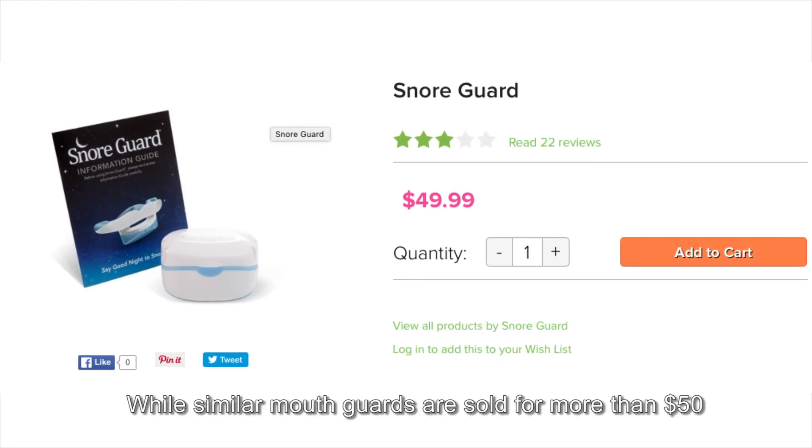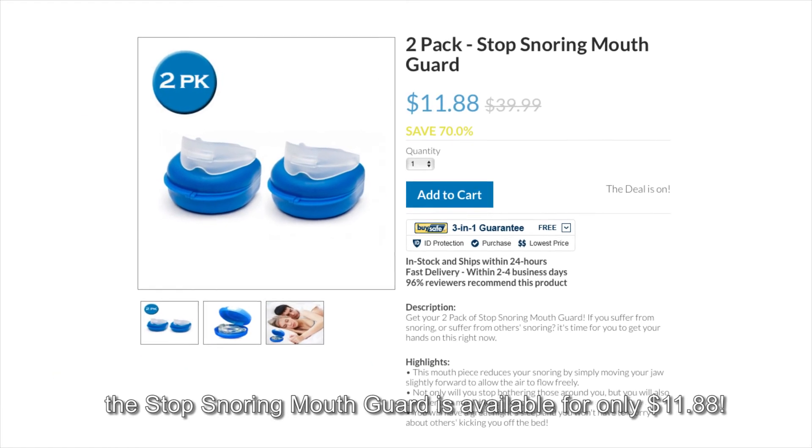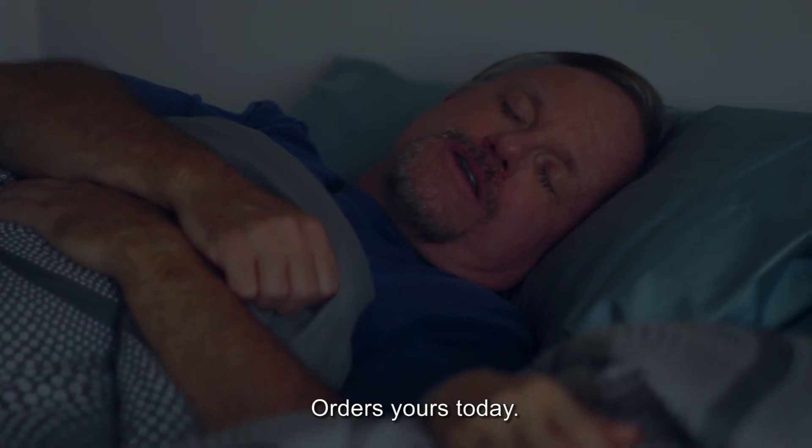While similar mouth guards are sold for more than $50, the Stop Snoring Mouth Guard is available for only $11.88. Order yours today.